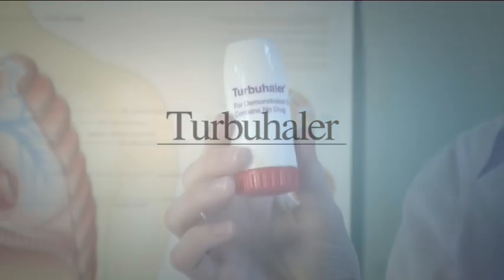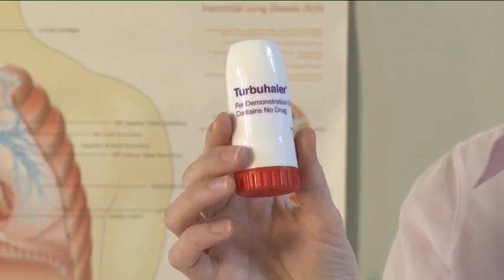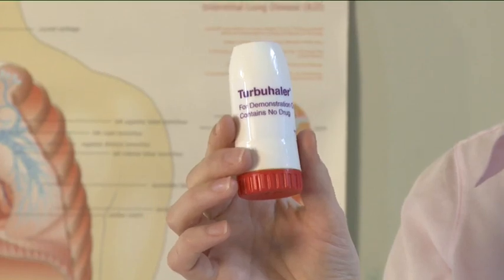Turbohaler. The Turbohaler is a dry powdered, breath-actuated inhaler. Before using your new Turbohaler for the first time, you need to prepare it as follows.